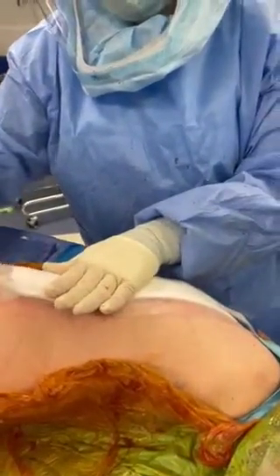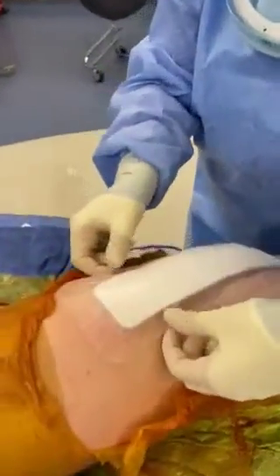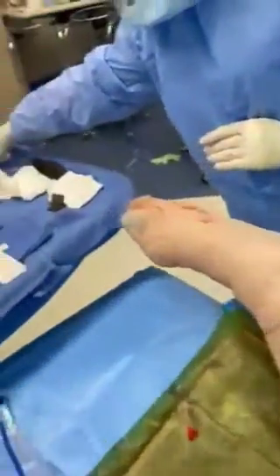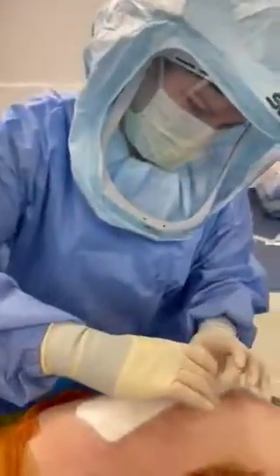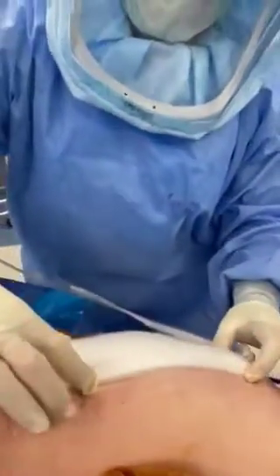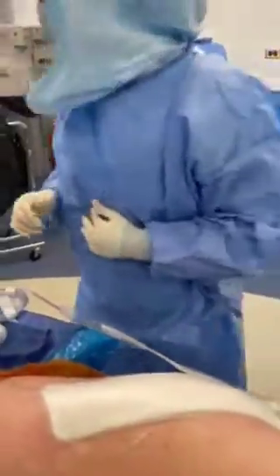Pull the second tab distally, and then you don't have to stretch at all. You just lay it and smooth it out really nicely there. So it lays nicely across the wound. Then we'll take our battery pack here. Just go ahead and screw it on. It's a simple one-click button, so we'll just press once, and then I like to give a little smooth around the white edges before applying any reinforcement to really get a good compressive effect there.